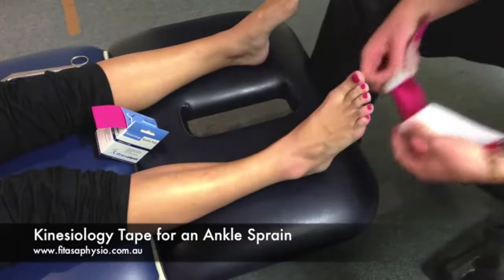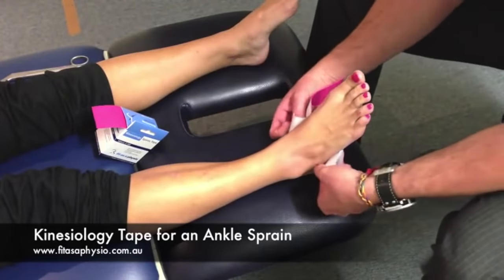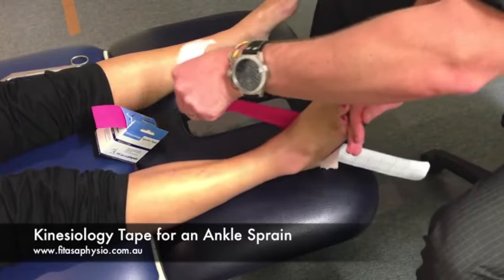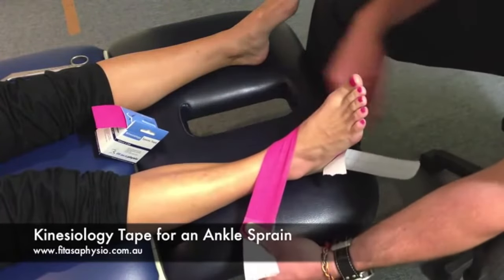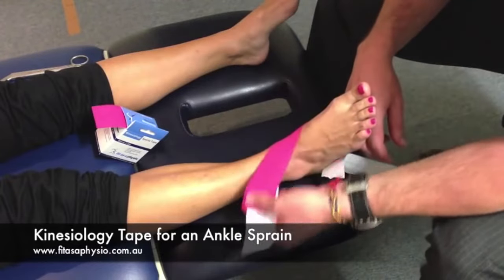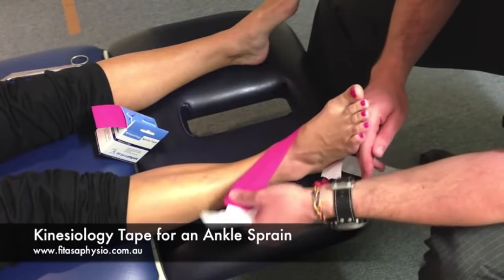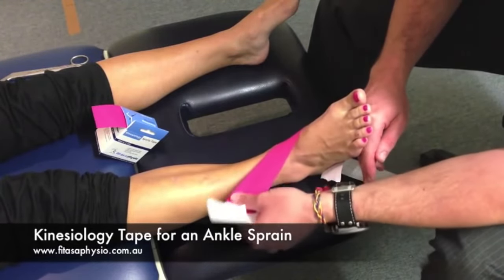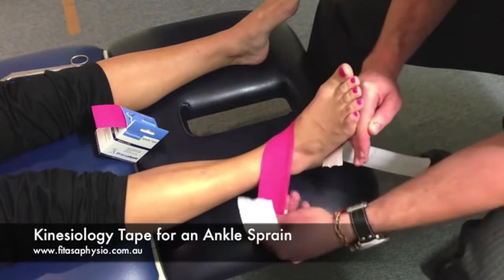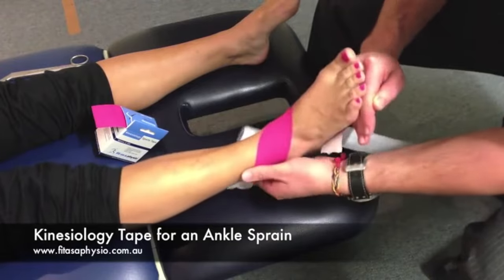I'm going to come under the rear of her foot from the middle and I want to do a figure of six up across the front of the ankle joint. Of the available stretch on the tape, I want it to be a bit restrictive, so I'm going to take it to probably 80% of its length — a figure of six up around the ankle.